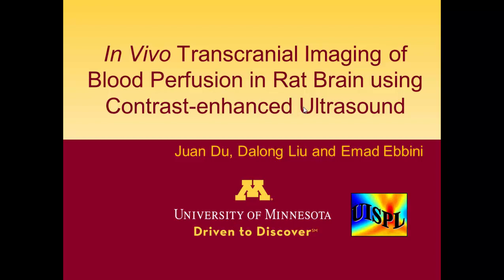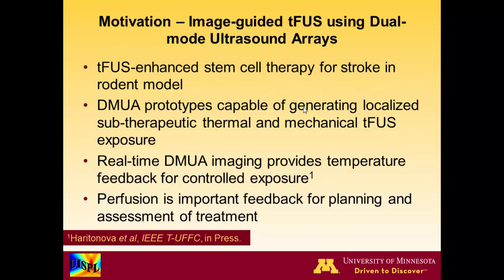And today I'm going to show some results we have about in vivo transcranial imaging of blood perfusion in rat brain using contrast-enhanced ultrasound. So first, motivation: our lab is interested in working on transcranial focused ultrasound-enhanced stem cell therapy for stroke in a small rat model.